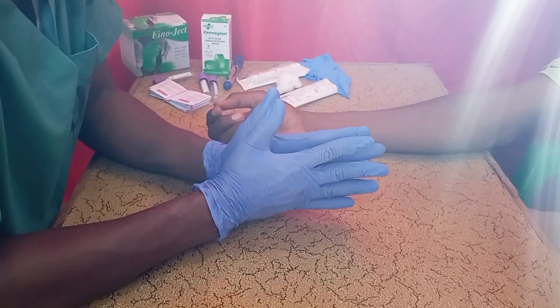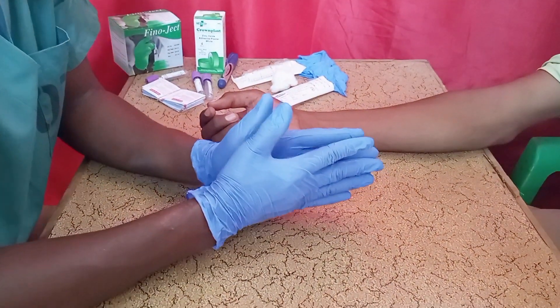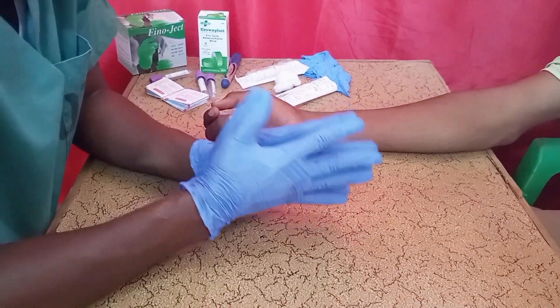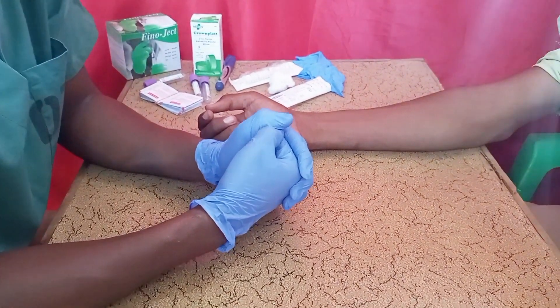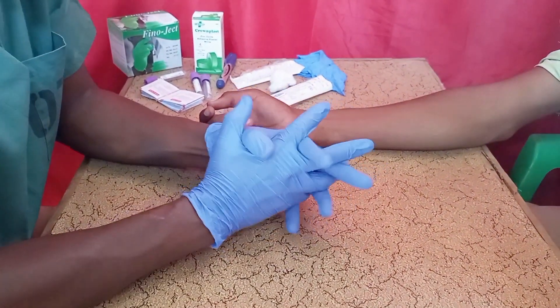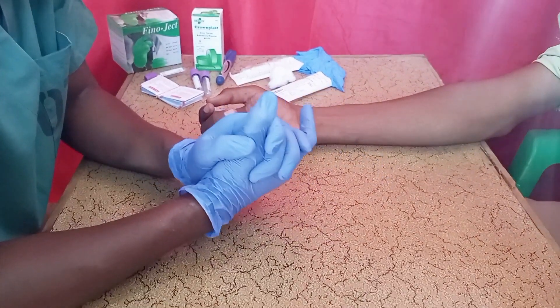Before you start the procedure, make sure you introduce yourself to the patient and gain their consent. For example: 'Hi, my name is Dr. Daud, I am going to draw your blood.' The patient should consent to the procedure before you begin.